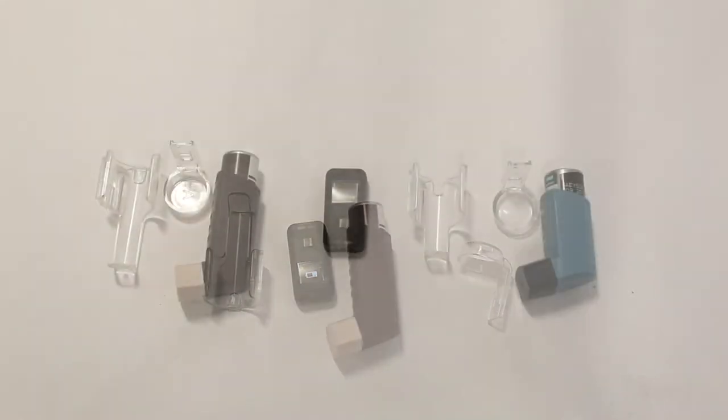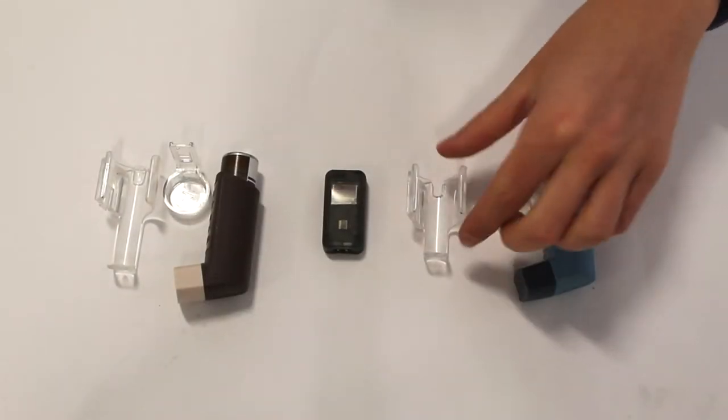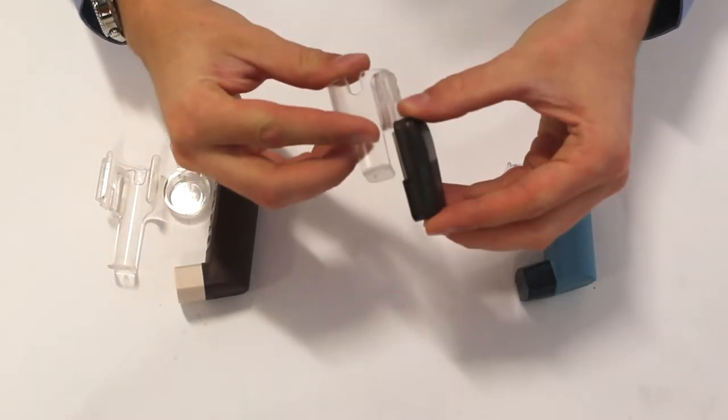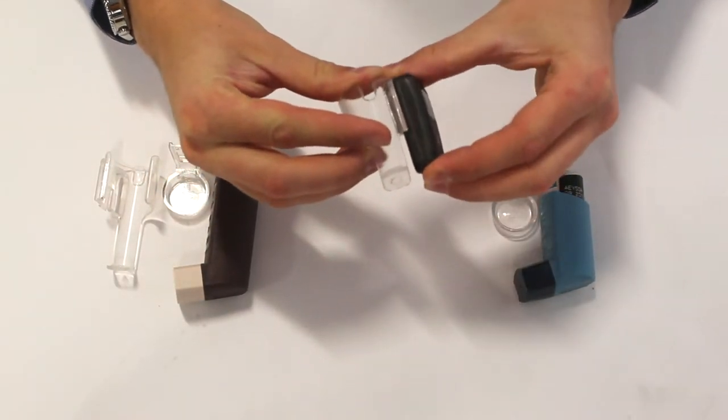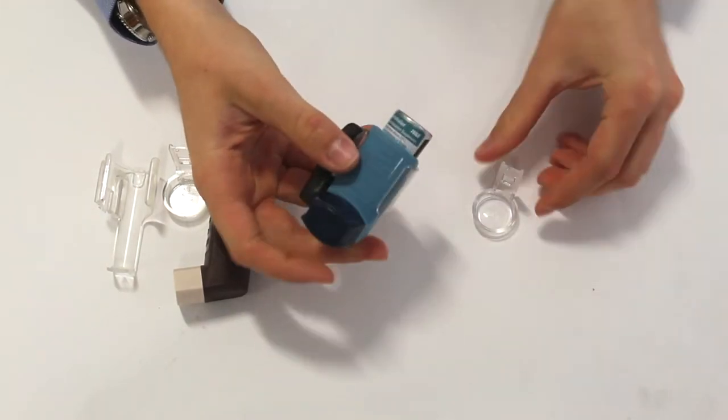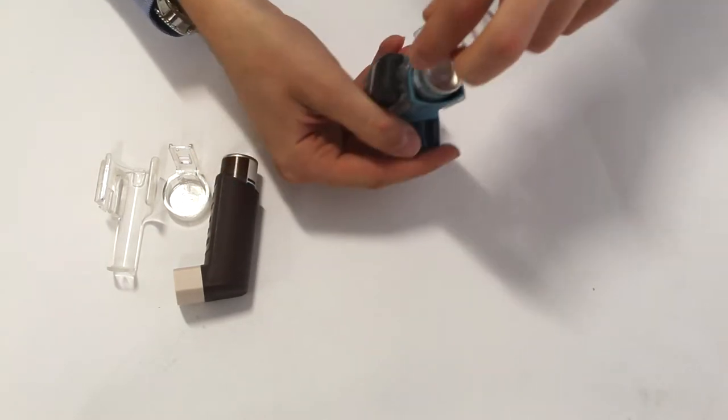The module can be placed onto a clip for a different type of canister. Again, assembling the module and the clip and the cap with an audible click when they're in place.